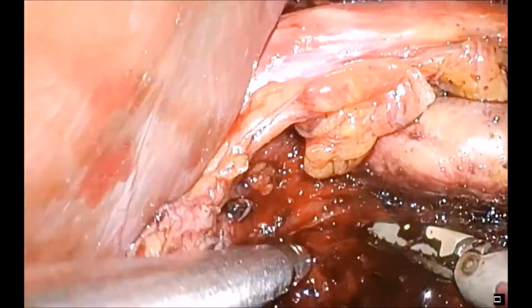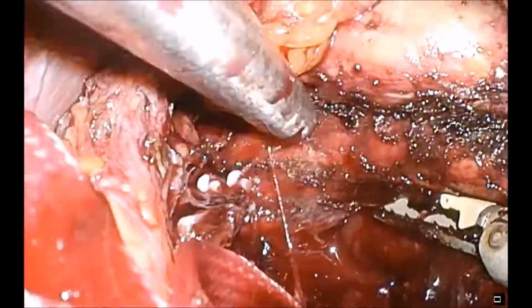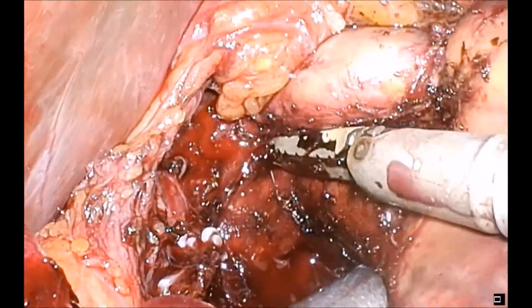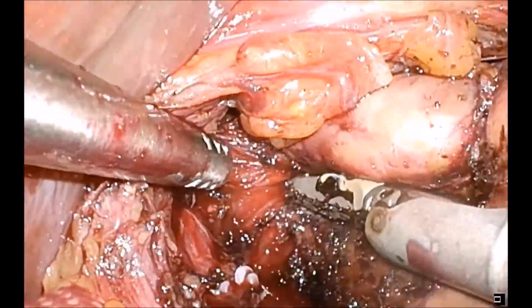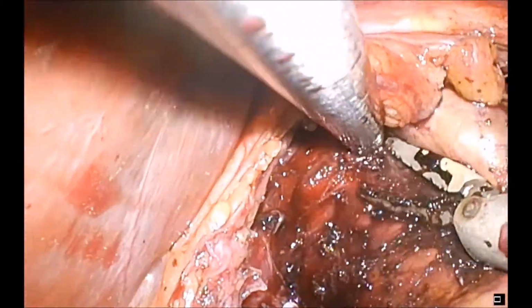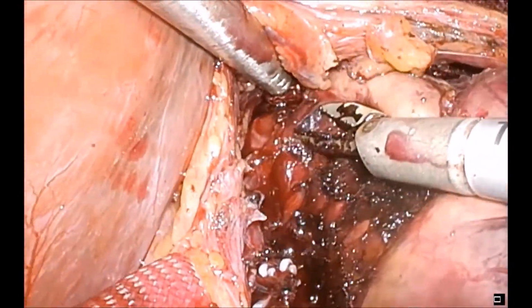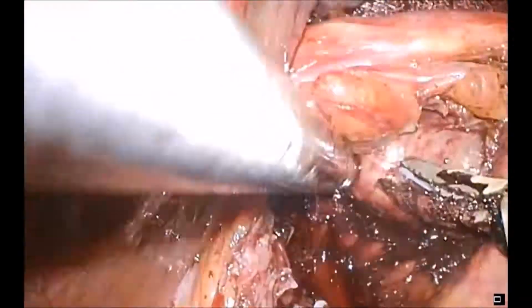Again, that artery being in the way is a little annoying, but we managed to work around it. The sucker's brought in now as there's a little bit of ooze, which is not unusual, but nothing major bleeding. The sucker can be quite a useful instrument as a retractor and a blunt dissector alongside an energy device such as the Thunderbeat.